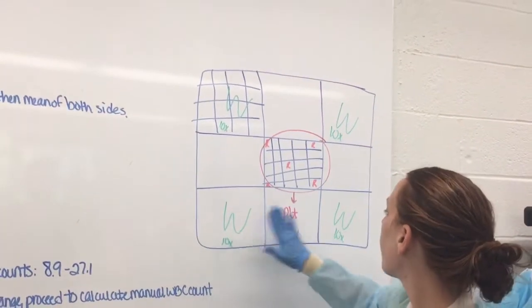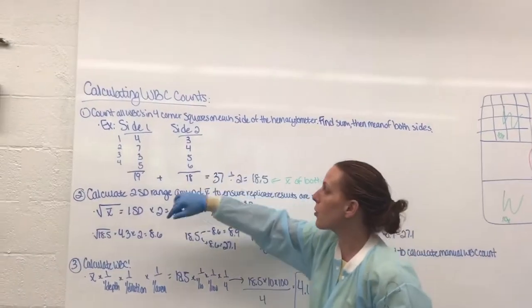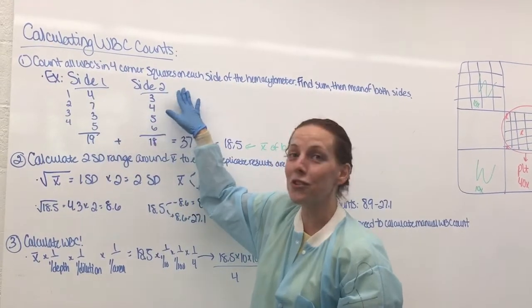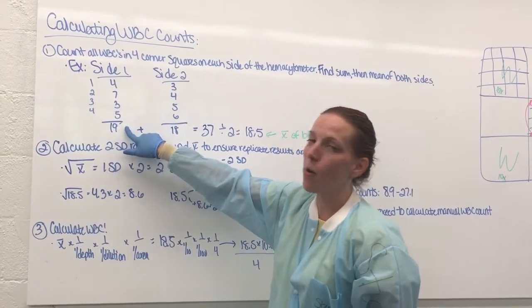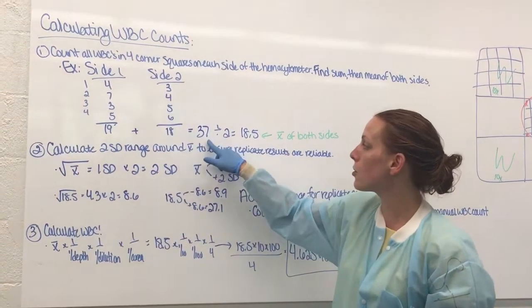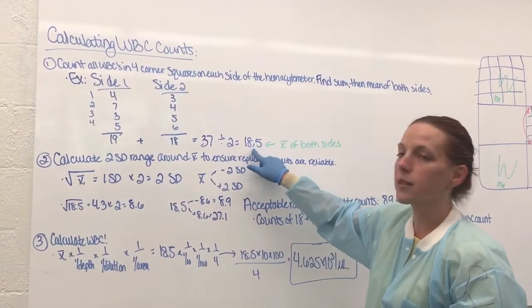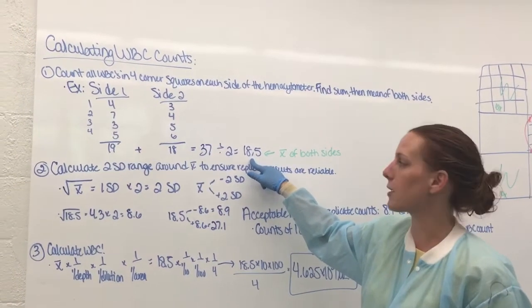So when we do our 4 large corner squares, we're going to count them all individually. You want to make a list of how many white blood cells you saw in each large corner square on each side of your hemocytometer. Then you're going to add them all up, get a total for side 1, get a total for side 2. Add those 2 things together, divide them by 2, and that's going to give you the mean. This mean right here is really important because this is what you're going to use in all of the rest of the calculations for how you figure out your white blood cell count.